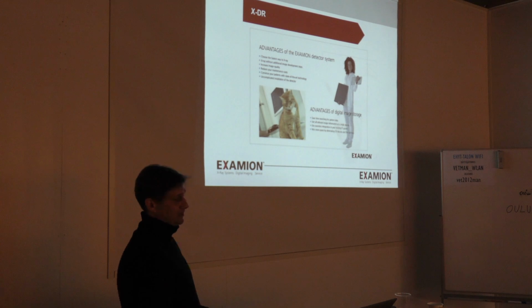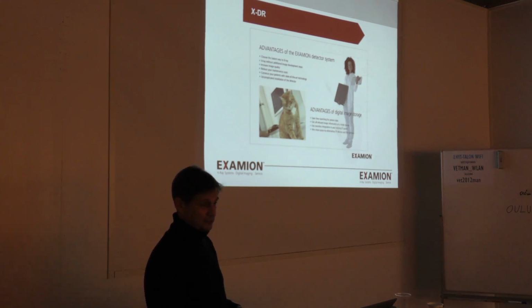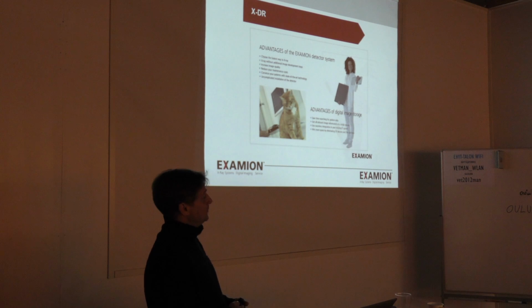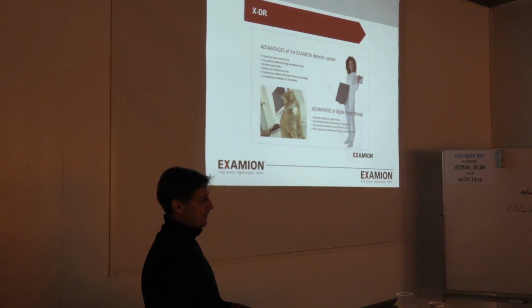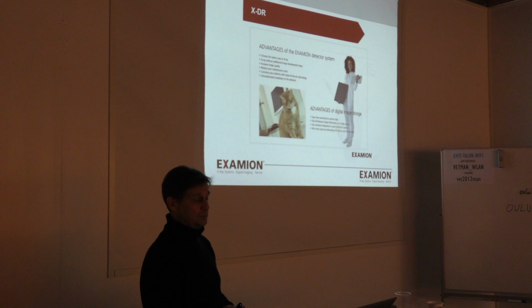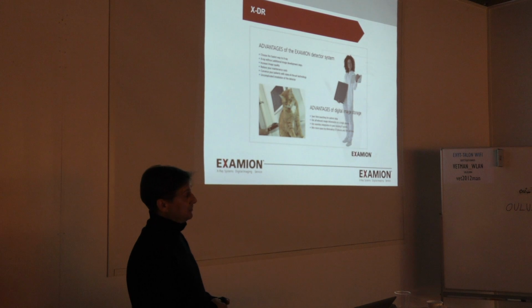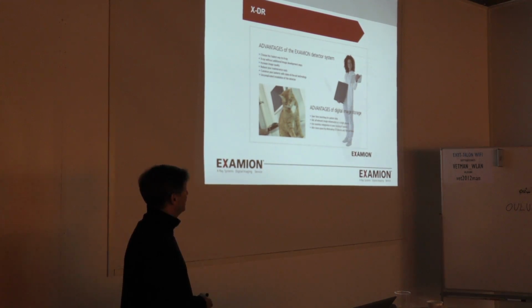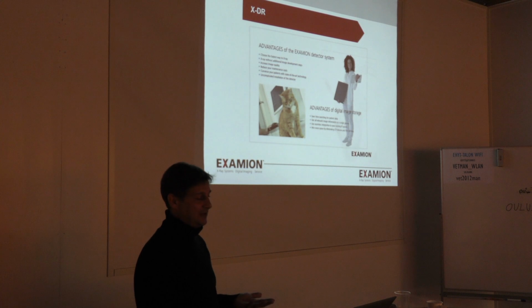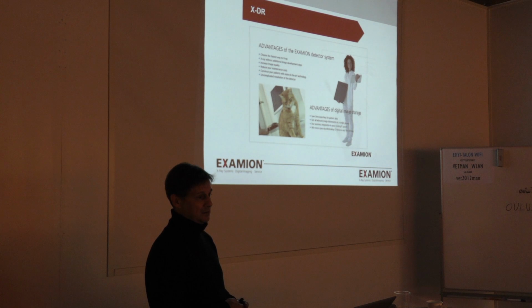A lot of other clinics, in the last probably 10 years, invested in CR systems, digital X-ray, where you have imaging plates put in a cassette and read, more like older cassettes with film, but still digitized. These days, because of market fluctuation plus readily available systems as upgrades, I would say practically 80%, 85% of the veterinary clinics that do invest would now invest in a DR panel.